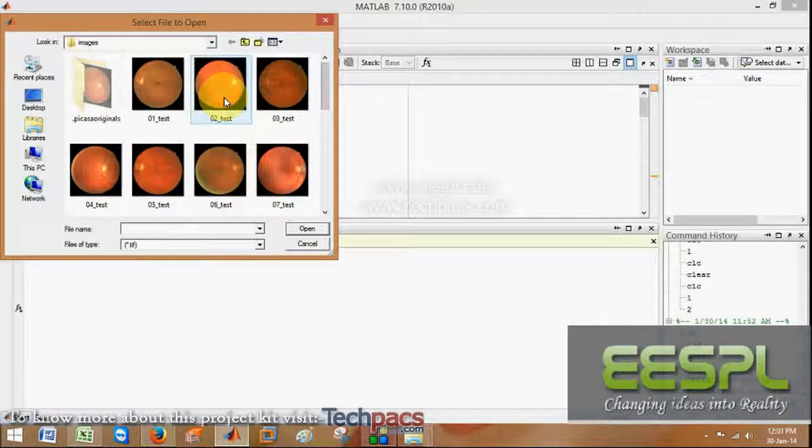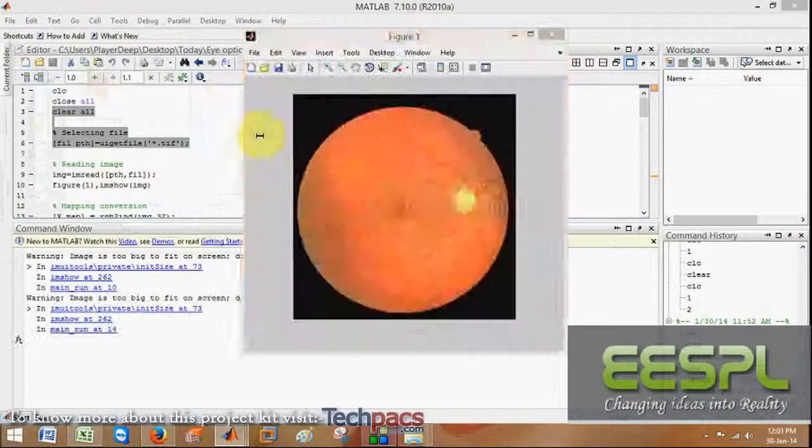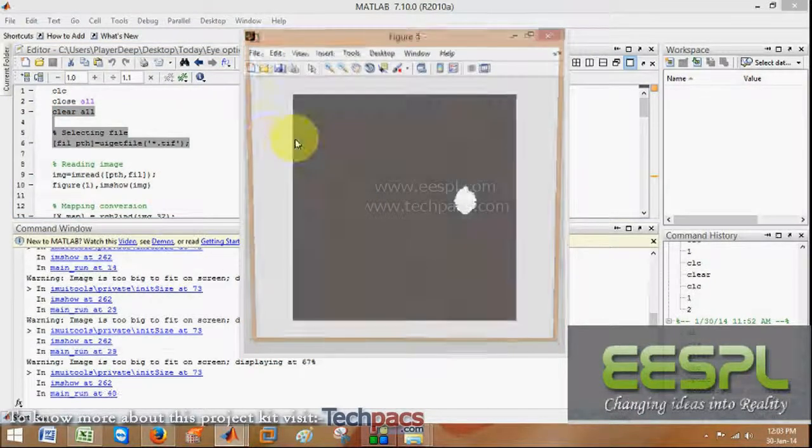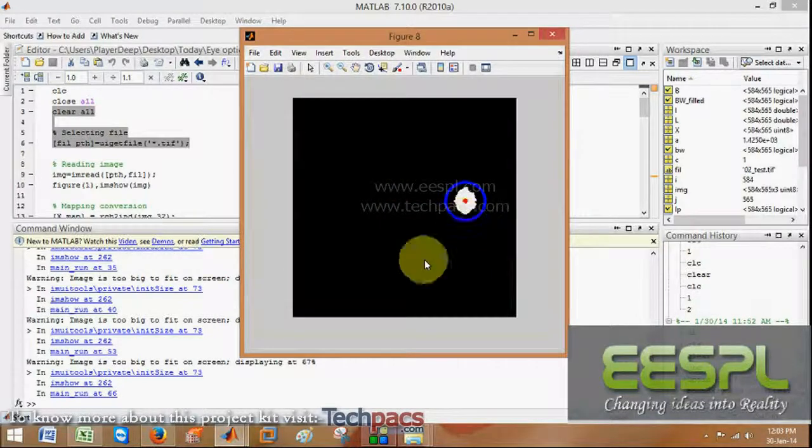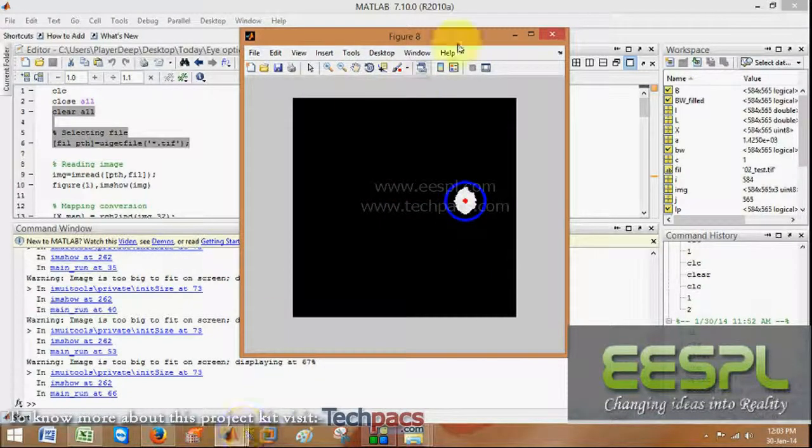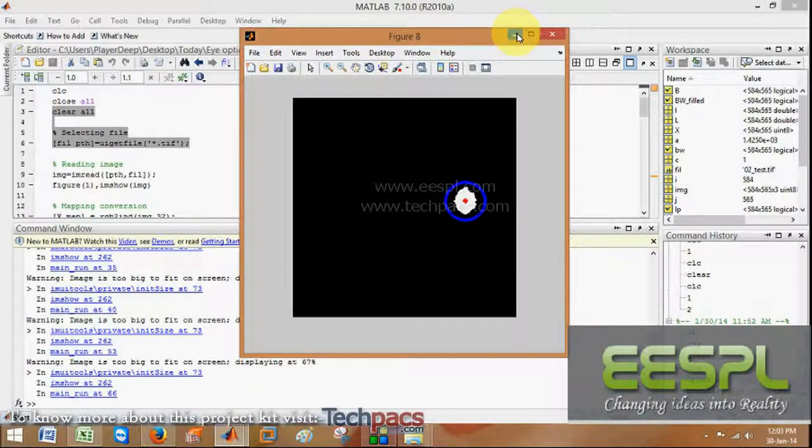I am selecting image number two. So these are generally the processes as you have seen.